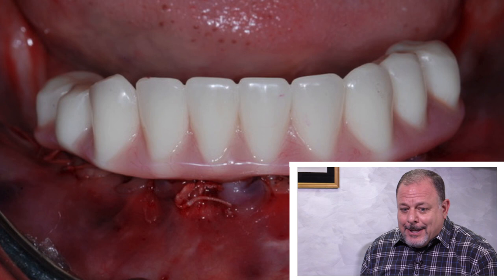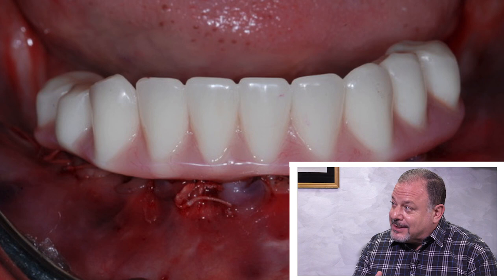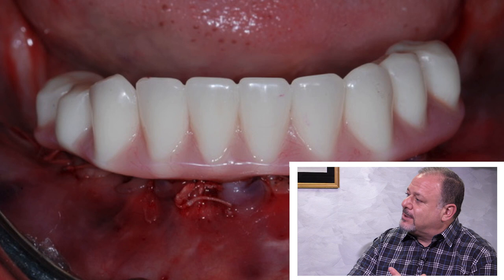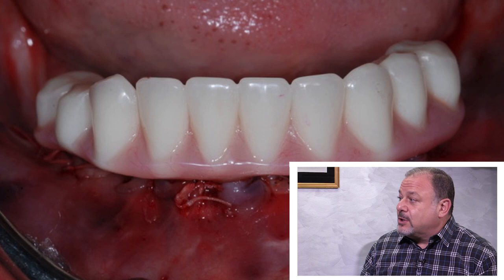Right. You can put molars, of course, and have a little bit. You can go back at 6 weeks. Now you're going to get pretty much where your tissue's at 6 weeks. You can always add a little bit to the flange. And, you know, you take that whole second phase of the treatment, definitive impressions, construction of a bar. That can also be taken out in different types of case types, which is another really good thing to pass on to the patient. Right. To make it more affordable for more people.